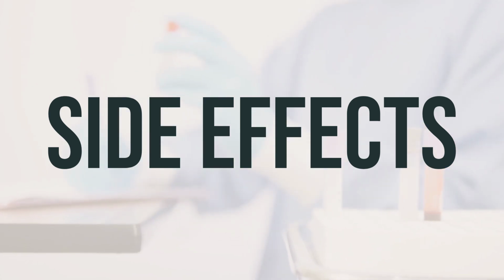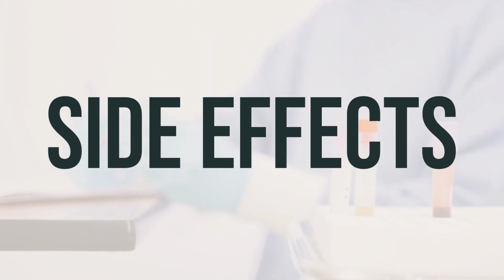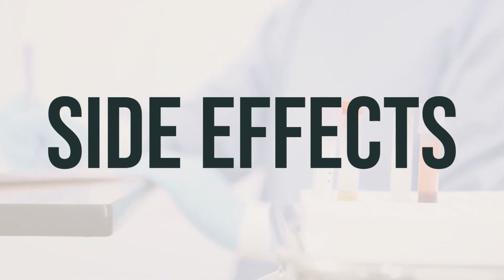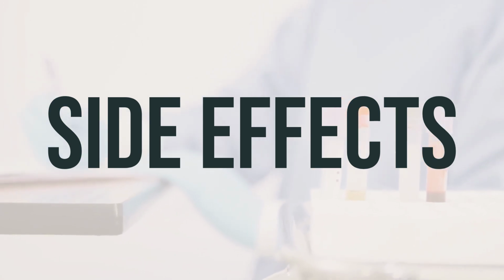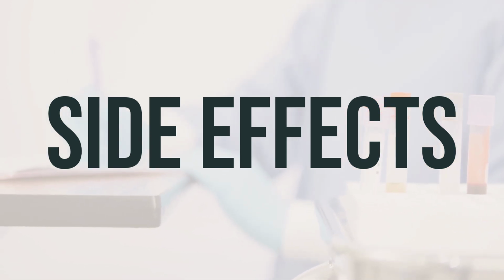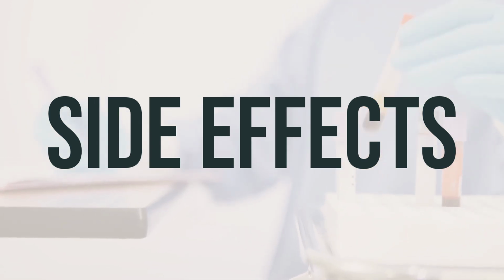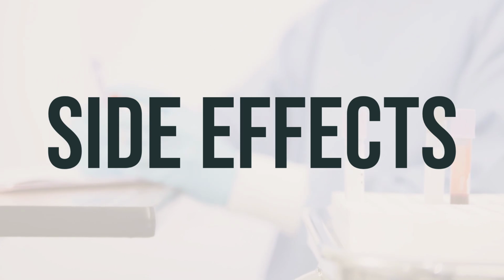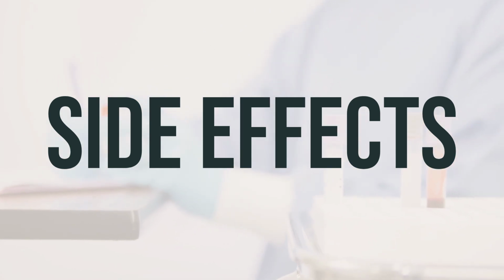Additionally, while rare, a serious allergic reaction to this device is possible. If you notice symptoms such as rash, itching/swelling, severe dizziness, or trouble breathing, seek medical help immediately. Finally, this is not a complete list of possible side effects, and it's essential to contact your doctor or pharmacist if you notice any other effects not listed. If you are in the US, report any side effects to the FDA, and if you are in Canada, report them to Health Canada.